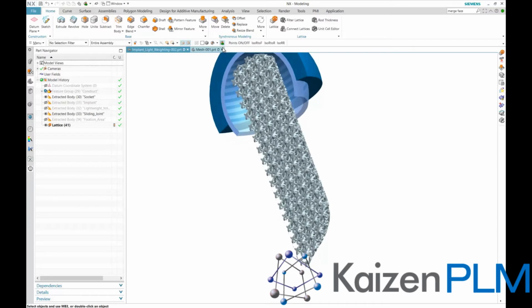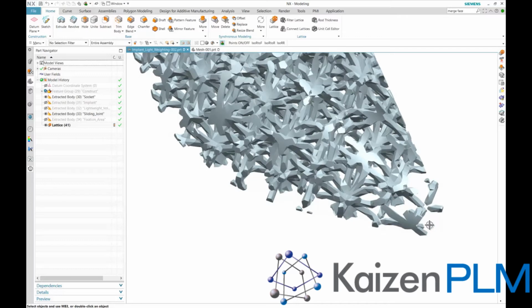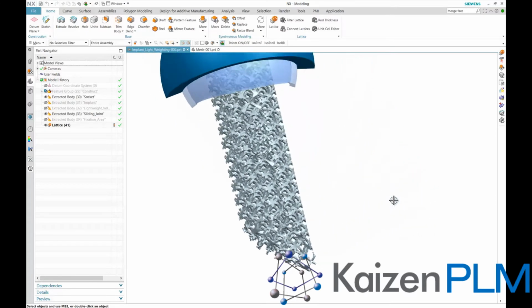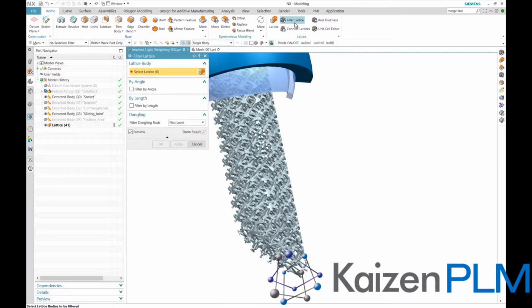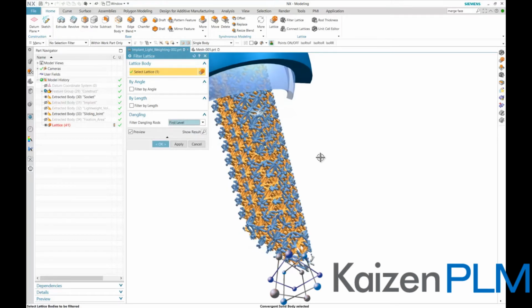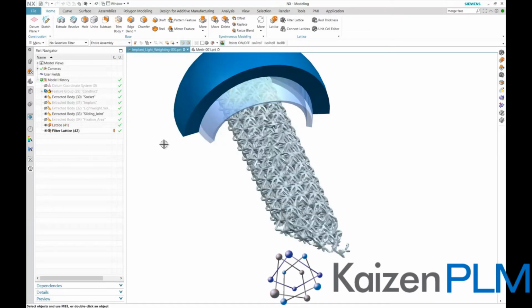We review the resulting lattice and notice that there are dangling bits. While in creation mode of the lattice, there are options to remove the dangling bits. In addition, you can also filter the lattice and create a filtered lattice with the requirements you desire. Here we choose to filter the first level, where NX filters rods not connected in both ends iteratively until it hits the first manifold vertex. Note that the filter creates an additional feature containing the filtered geometry.